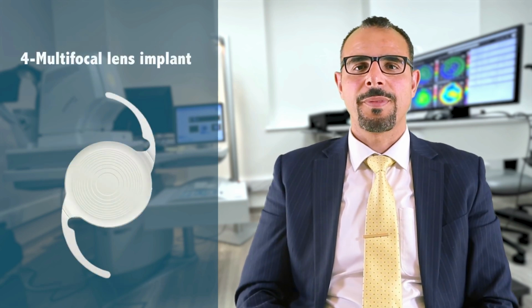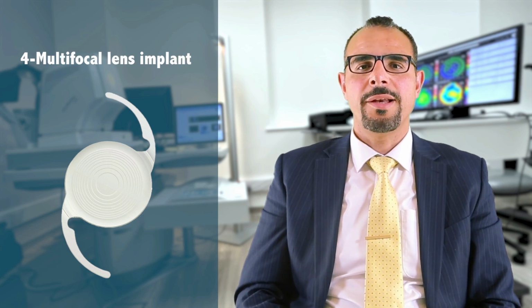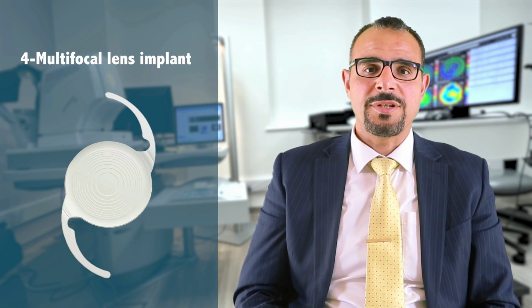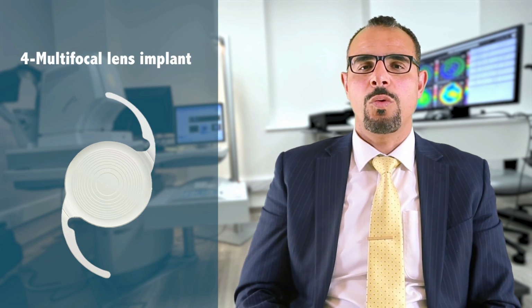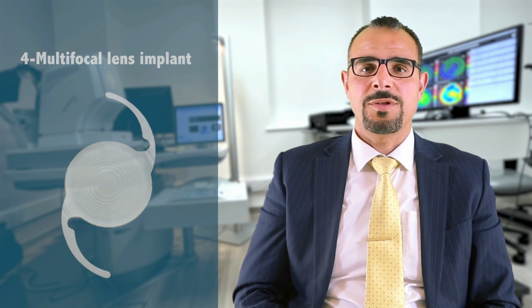Multifocal lenses. This category of lenses works in a similar way to varifocal glasses. They aim to correct distance as well as near vision. They work well for many patients. However, some patients may experience some glare or light sensitivity with them. They need very careful selection before the surgery.